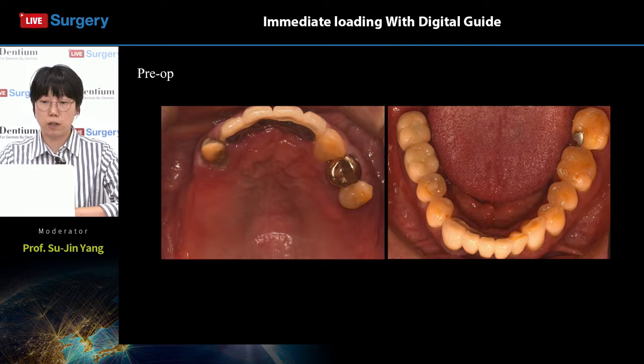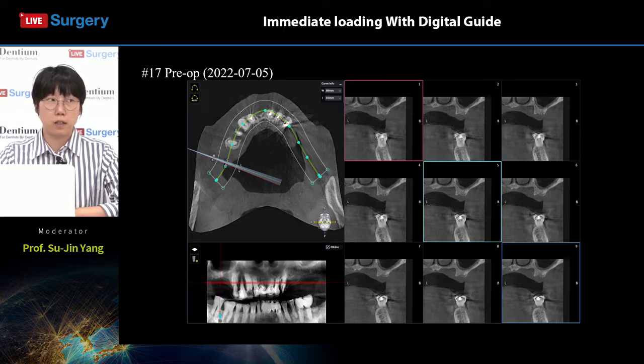Therefore, further crown treatment on tooth number 14 and 23, or in worse possibilities, extracting these teeth and putting an implant in that area as well, and splinting the implant crown with the remaining implants can be considered in the future. Now we will go over each site upon the CT scan.